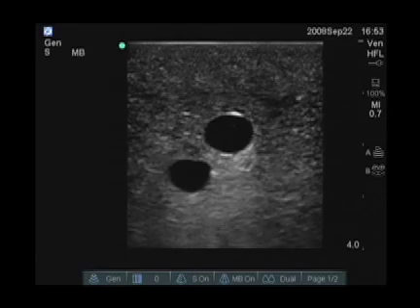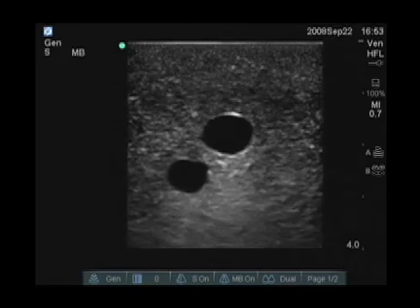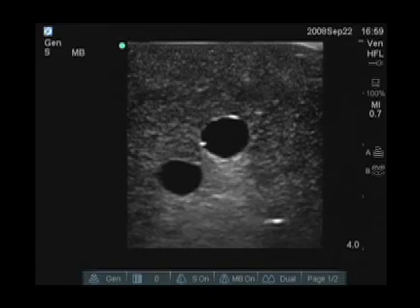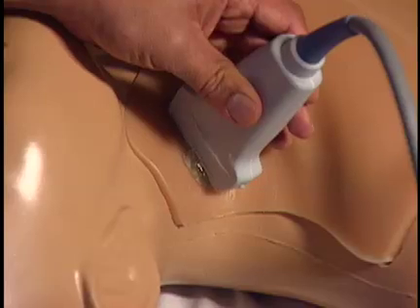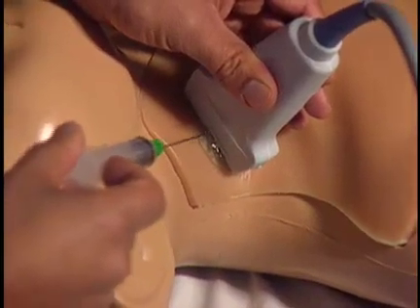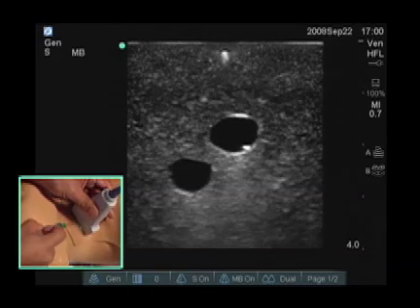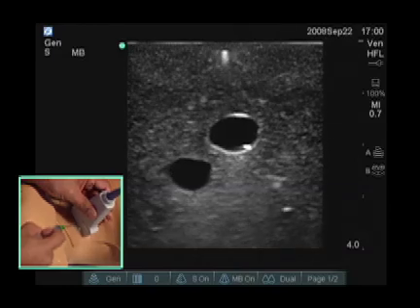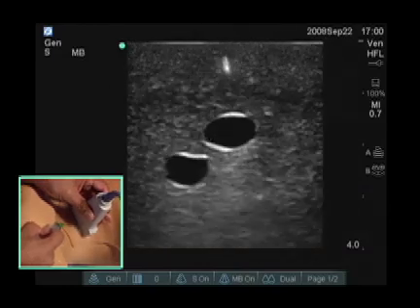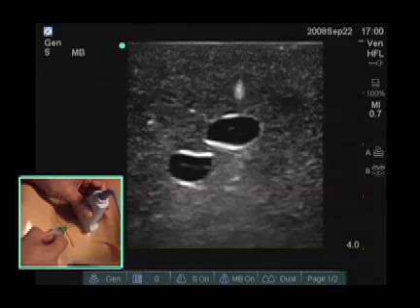I put the target — the jugular vein — in the center of the image. We know that the jugular vein is about a centimeter and a half deep in this case. I'm now going to show you how you can follow the needle tip as you slowly march toward the vein. I take my needle and put it right adjacent to the transducer at the mid part — we can see the needle tip. As I slowly advance, I angle the transducer away from and then toward the needle tip, so I always have the needle tip in the field of view. I can always keep track of how far I've gone, and I do this nice and slow.